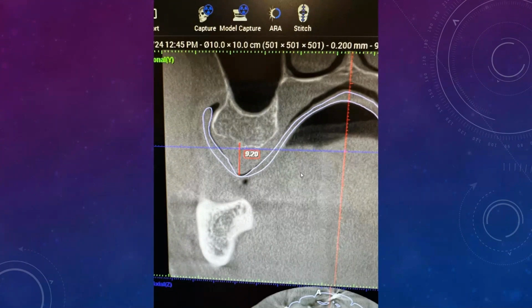And oftentimes patients don't wear their lower partial, or their partial needed to be relined or something like this, and they put a lot of forces on the anteriors, right? And that causes that rotational force of the maxillary denture, causing some suction in that area. And that causes that tissue to hang down.